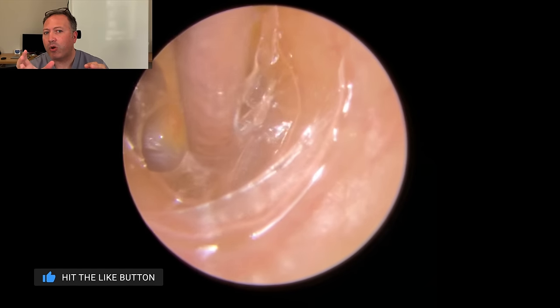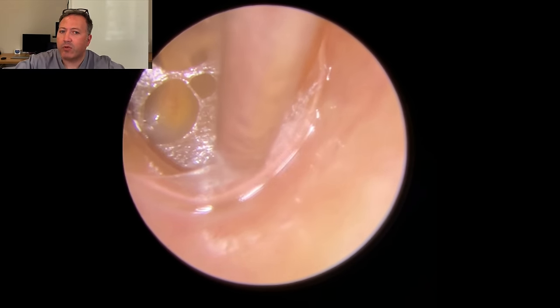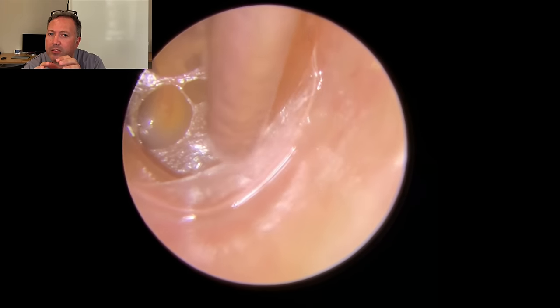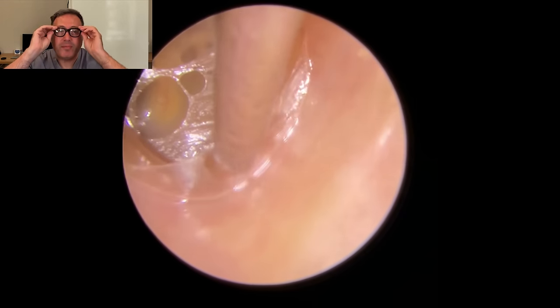I want to try to take the whole thing away in one go if we can, because if this folds flat against the canal wall, it's going to be really, really hard to lift that back off again. So I just realized I left my blooming glasses off again.